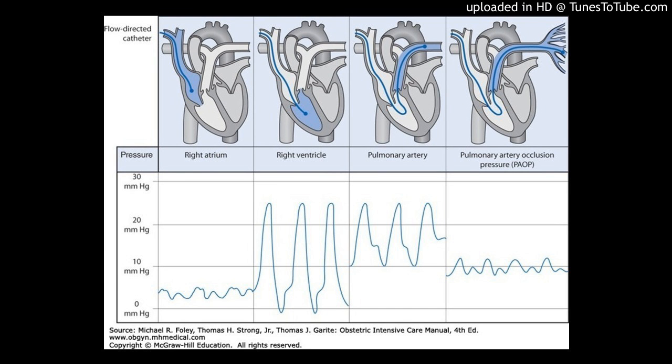Pulmonary vascular resistance is better characterized by multi-point pressure, flow measurements than by single-point determination. Multi-point pulmonary vascular resistance calculation could be useful for early disease identification as well as for treatment response assessment.